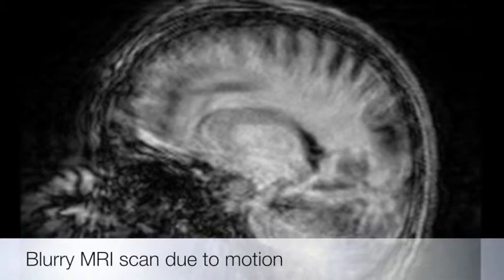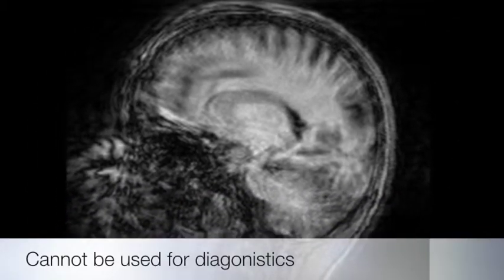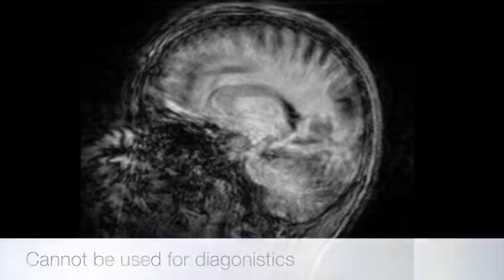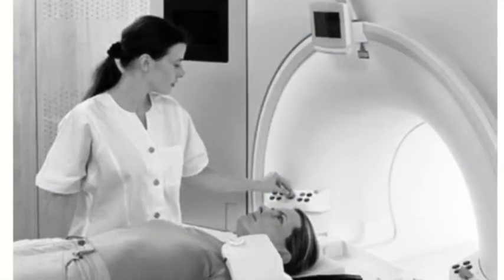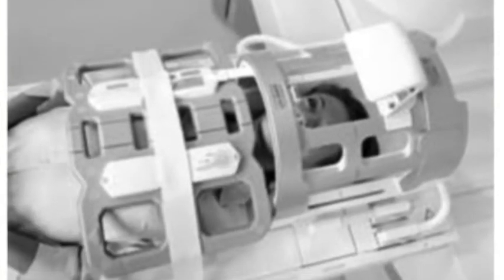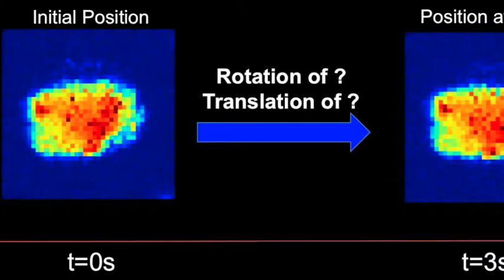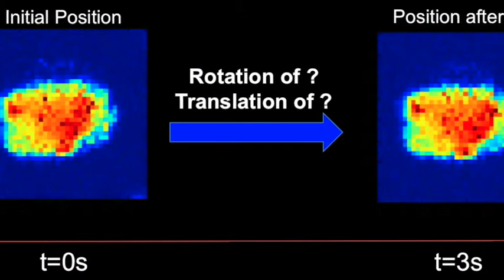Subject motion during an MRI scan can cause substantial corruption in images, reducing diagnostic accuracy. Often, the corruption can only be solved by redoing the entire scan, increasing scan time and cost, and reducing patient comfort. Therefore, motion detection and correction during an MRI scan can be extremely helpful.